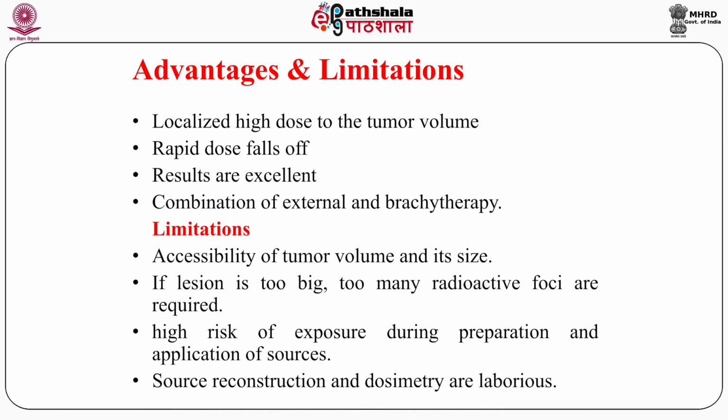Next is high risk of exposure during preparation and application of the sources. During preparation of the sources, there is a chance of high doses to the persons, but that limitation is overcome by remote afterloading system. Source reconstruction and dosimetry are laborious.